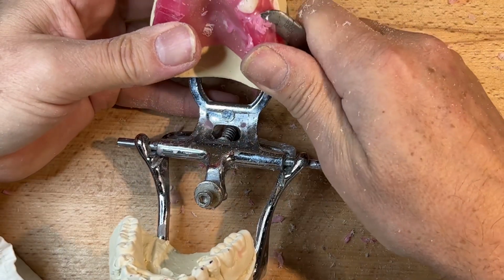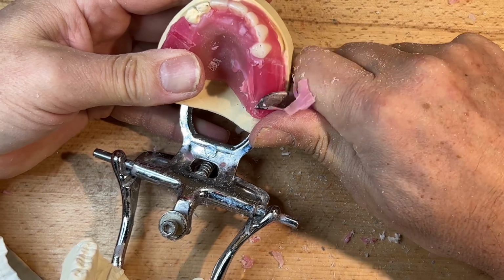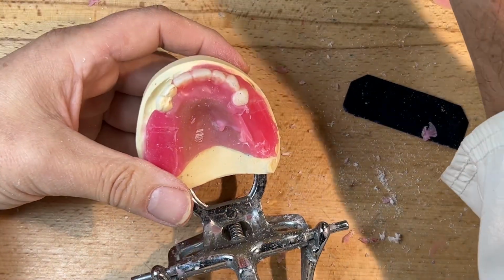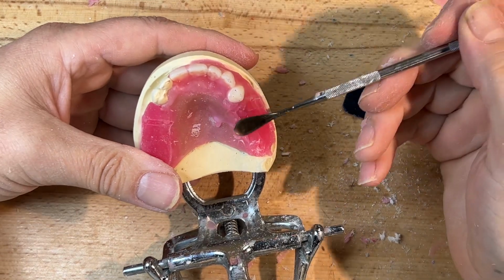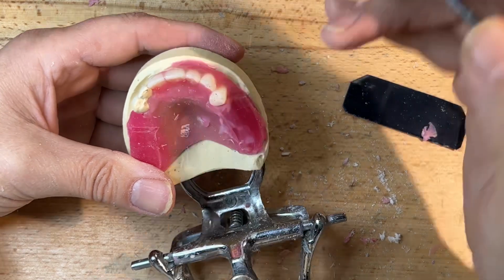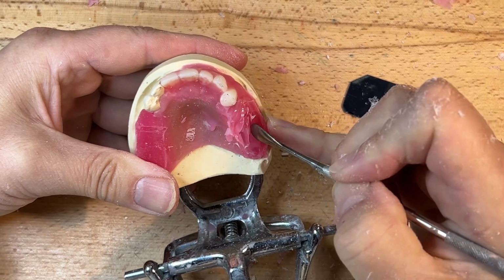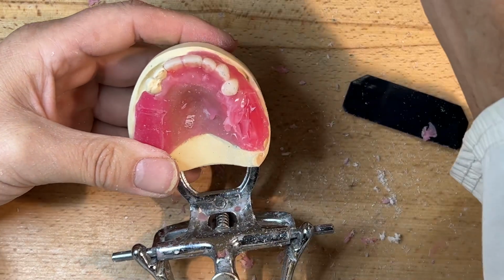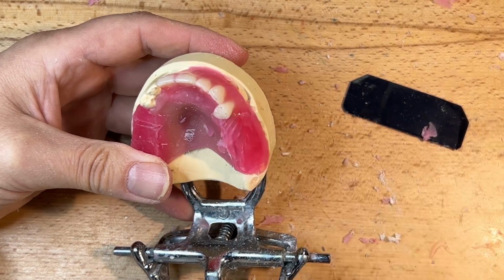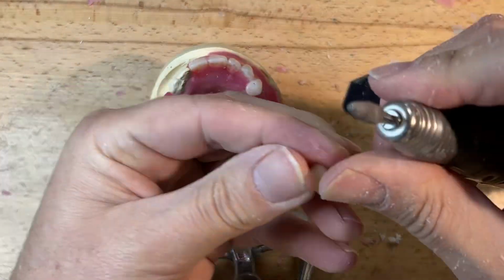Now, you obviously have to look at the opposing dentition. Do they have 2 bicuspids? Are there diastemas? Is there a molar? I think we're going to attempt to get all 4 posterior teeth out here, 4, 5, 6, and 7. Soften the wax. You can use an alcohol torch if you like. I don't want to have any of this wax interfering with my setup.